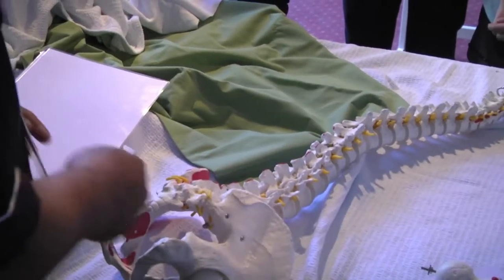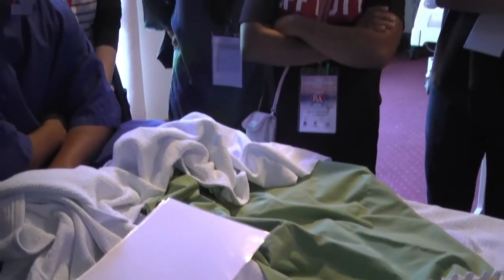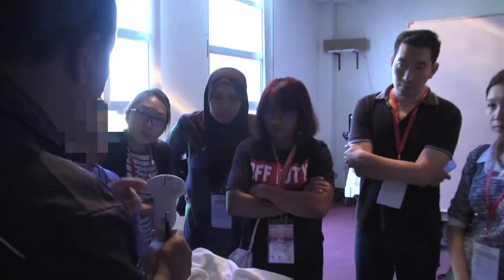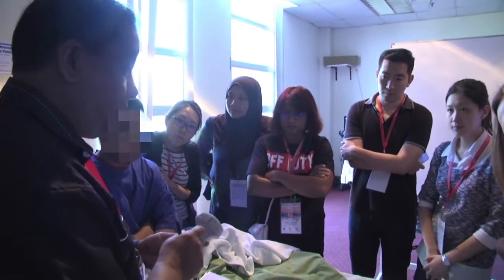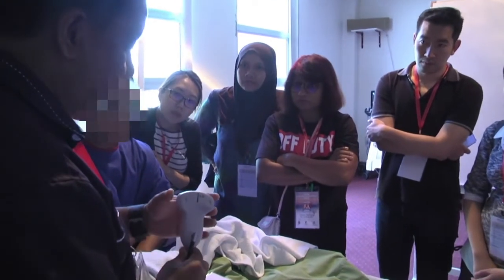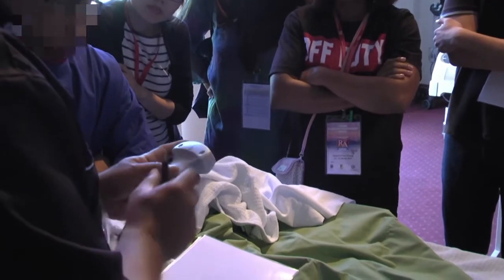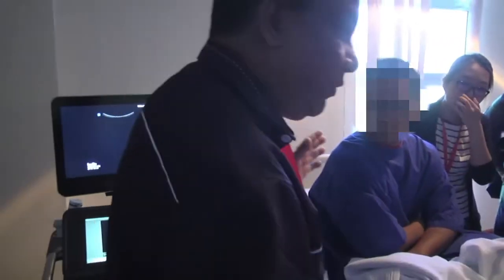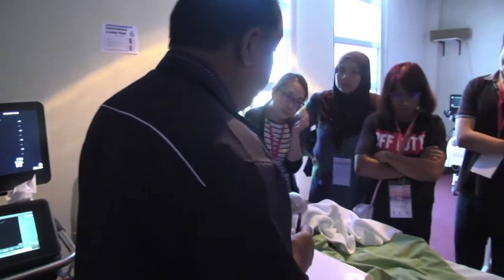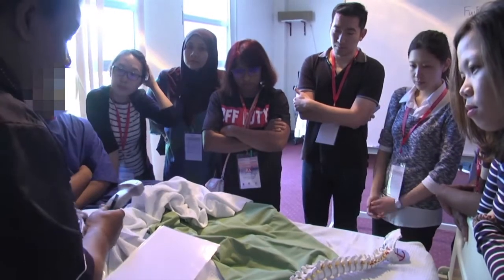Now, there are a few fundamental things you need to understand about imaging of the spine. Because the spine is a deep structure, you need to use low frequency ultrasound. This is a 5 to 2 megahertz probe. It's a broadband, meaning it serves multiple frequencies, and it gives you a divergent beam. So it gives you a wide field of view, and imaging can be quite good even in deep structures. The low frequency will penetrate deeper and give you good visualization.